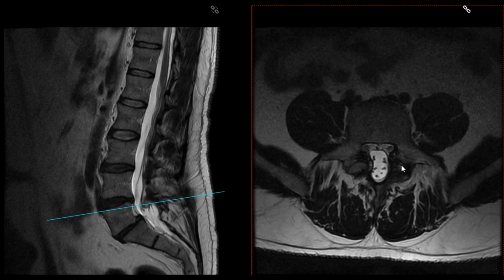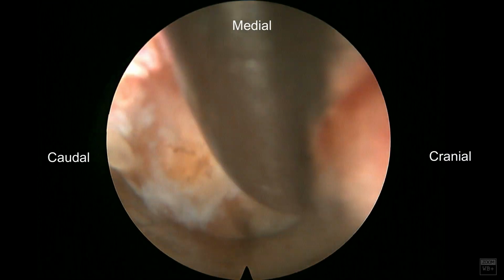And so I came to this conclusion when the patient was only complaining of right hip pain and also didn't fully travel down the leg, and he had no pain on the left side. So we indicated a hemilaminotomy and decompression of that lateral recess. So this is the initial start of our decompression.